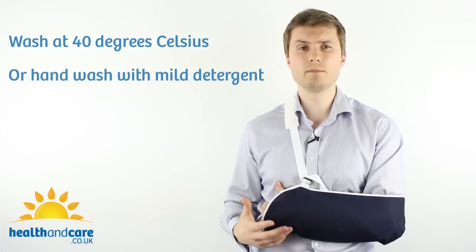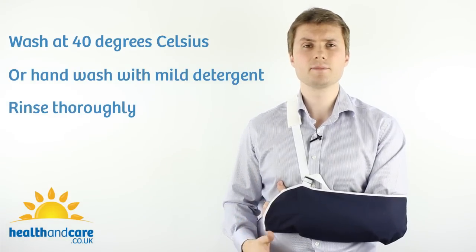Washing the sling is really straightforward. You can wash it at 40 degrees Celsius or you can hand wash it with a mild detergent, rinse thoroughly and then air dry.